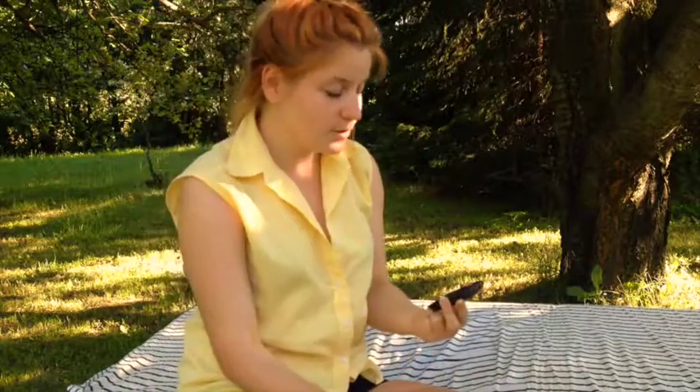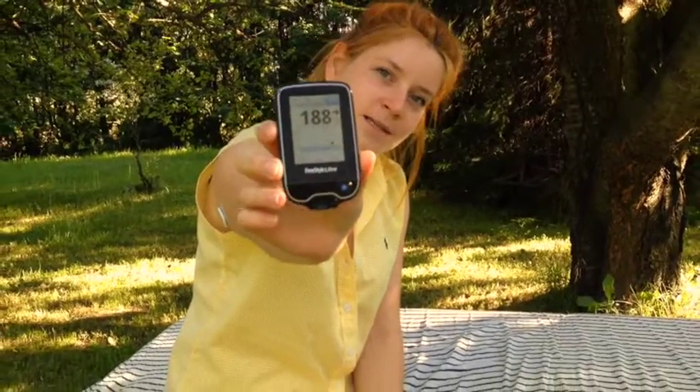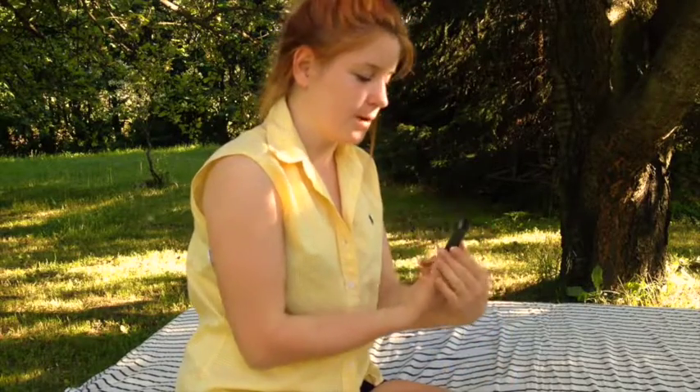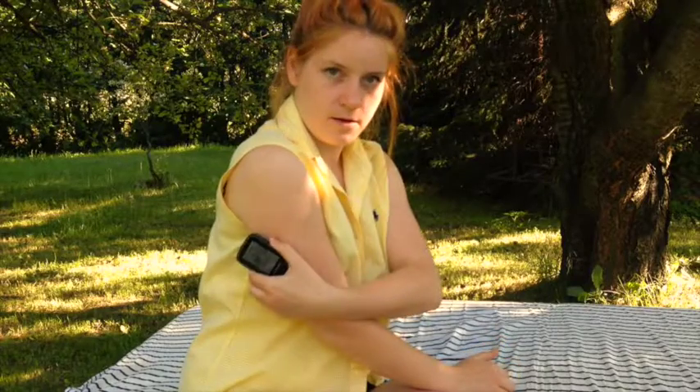188. No nie najlepiej, ale trudno. To jest właśnie Flash Glucose Monitoring, czyli mierzenie tzw. flash przy przykładaniu. Od momentu, w którym podłączyłam sensor, on już rejestruje wyniki, ale rejestruje je w sobie. I w momencie, kiedy robię ten magiczny pyk i go przykładam, wysyła wszystko co zebrał do czytnika.